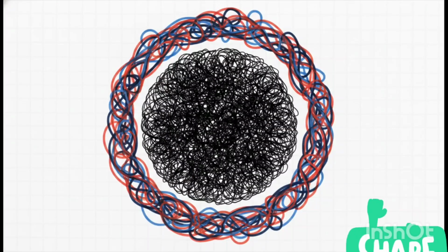Now, to differentiate a fibroid from other possible uterine masses, color Doppler is absolutely your best friend. When you switch that on, look for peripheral vascularity. You're often going to see this prominent ring of blood flow hugging the outside of the fibroid. That peripheral pattern is a classic sonographic signature confirming that it's behaving exactly like a leiomyoma.